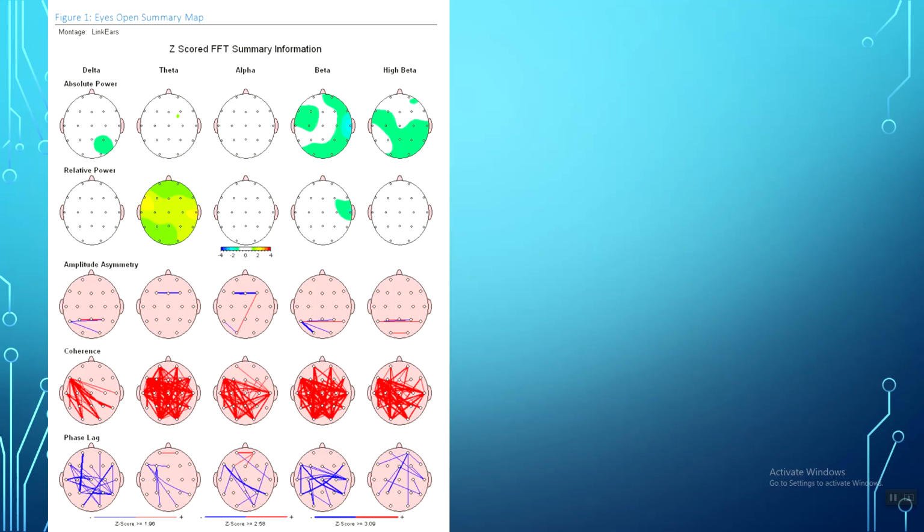Now that rigidity means that we have a synchronization of frequency. Hypercoherence in delta is delta synchrony or hypersynchrony. Hypercoherence in theta is hypersynchrony in that frequency. And so what you have to do is apply the adjective of the frequency to the modality of overconnectivity.